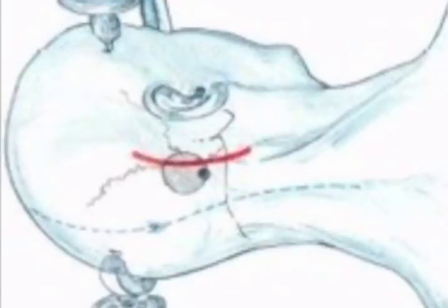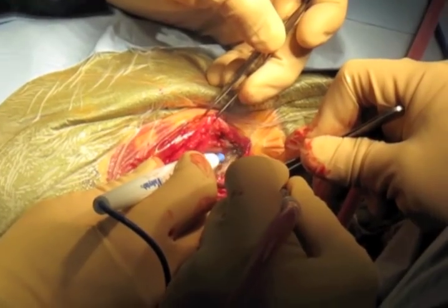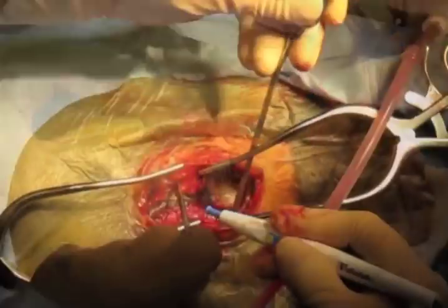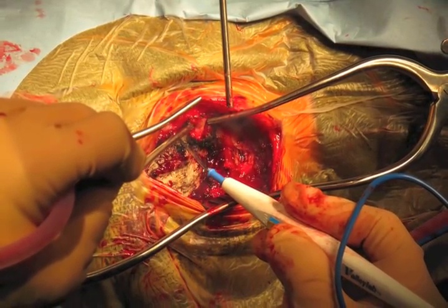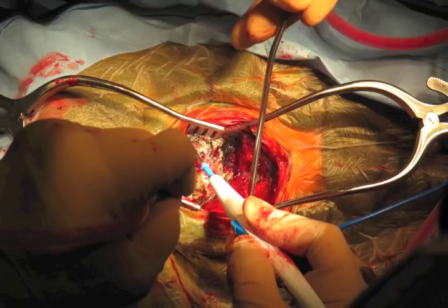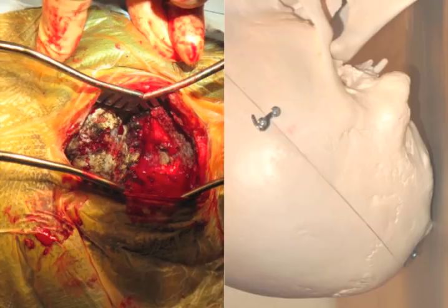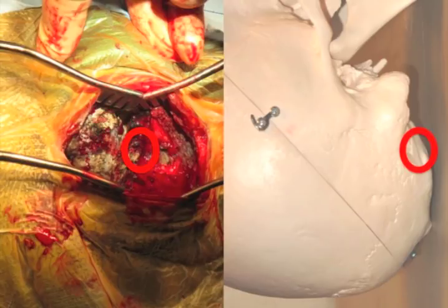A linear incision is made as planned down to bone over the occiput and down to muscle more caudal. The suboccipital bone is exposed and the dissection is carried down to the level of the foramen magnum or C1 depending on the size of the craniotomy or craniectomy needed. A combination of Bovie cautery, bipolar cautery, and gentle traction are used to remove soft tissues near the foramen magnum. Cerebellar retractors are used to maximize exposure. Adequate bone visualization includes a portion of the mastoid process, the asterion, and the low occiput approaching the foramen magnum.